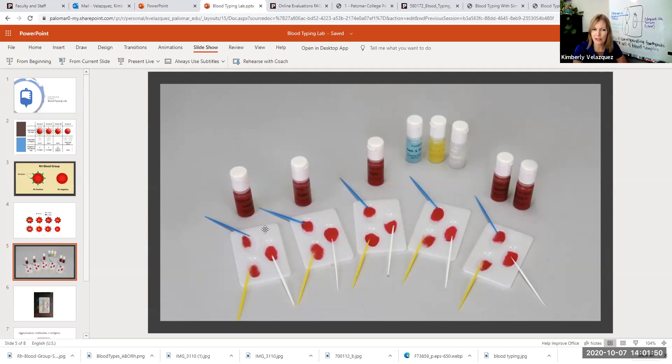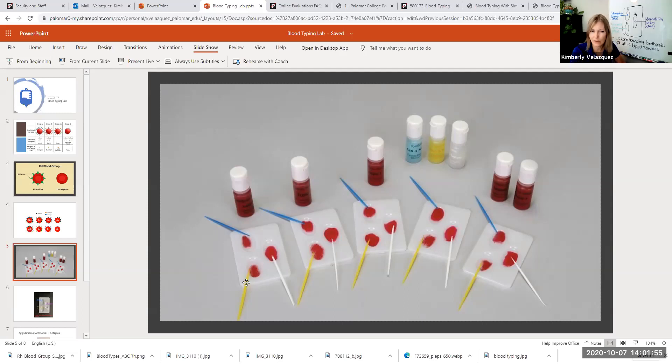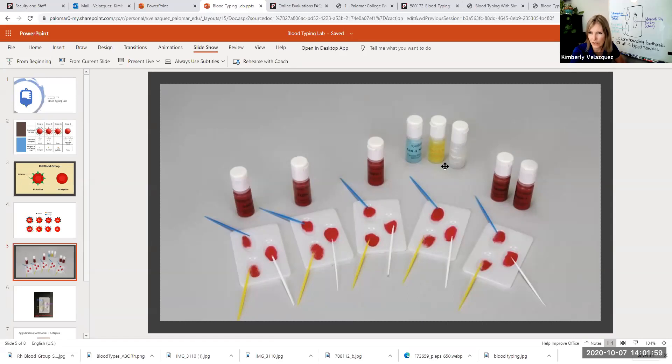You cannot have any trace of the prior blood sample or the anti-serums in your test tray. So make sure you clean them very, very well after each test that you run.